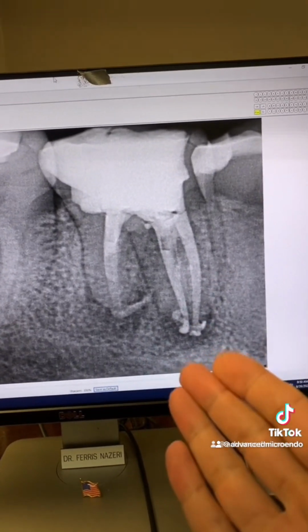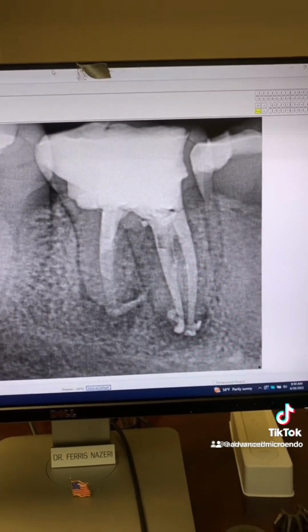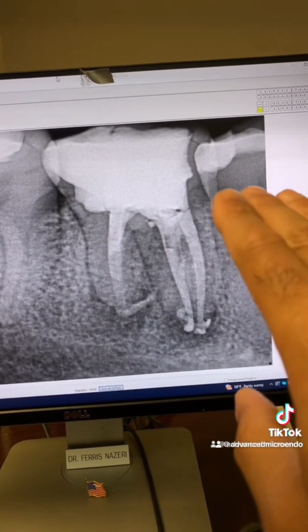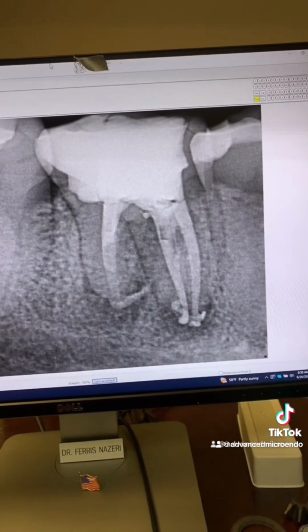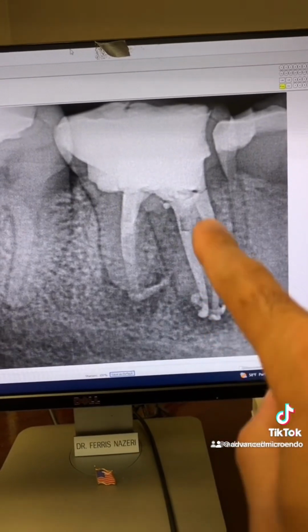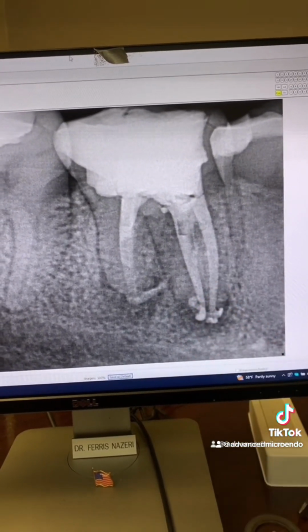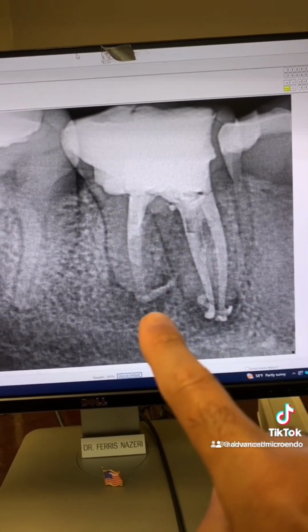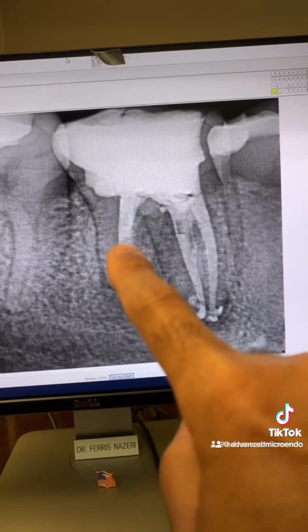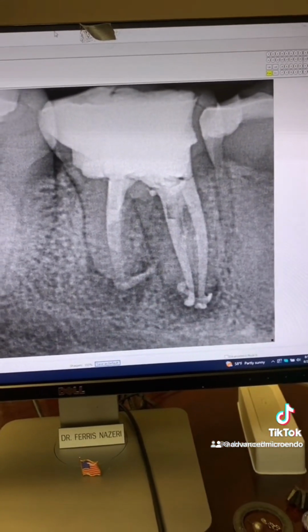As you can see, everything went beautifully, removed the old gutta percha and irrigated three-dimensionally, of course reshaped and re-instrumented and everything. Activated full strength sodium hypochlorite, 6% sodium hypochlorite, sonically and ultrasonically. Look at that beautiful anastomosis between the mesial canals. The apical diameter of the distal canal was over 50, so I placed an MTA plug followed by gutta percha and sealer and temporized the tooth and referred the patient back to his dentist.